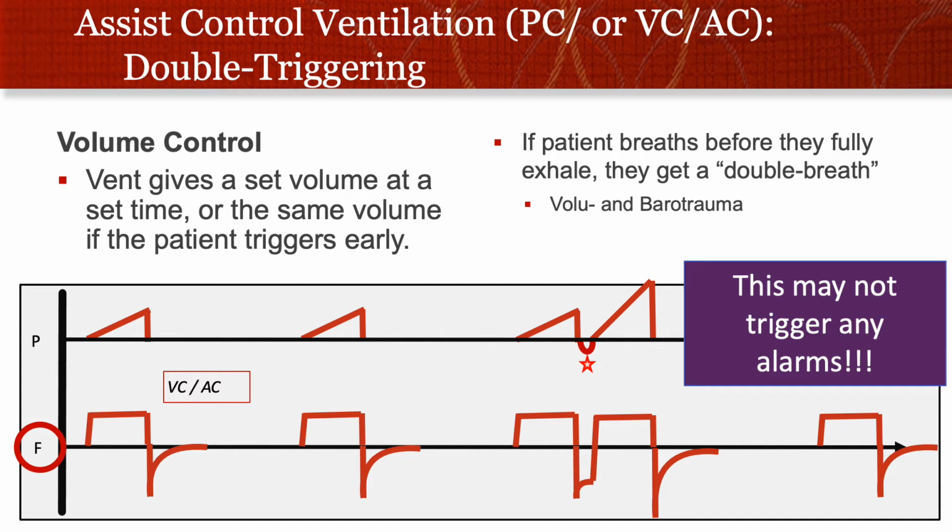We're breathing barely enough. They're acidotic. Well, that's a huge trigger to breathe, and so patients want to breathe. They're septic and have metabolic acidosis. They want to breathe that acid off. And so they want big breaths, and they want them all the time. And so they may say, my 300, 400 mil tidal volume is not enough. I want more. And they'll suck in air before they have fully breathed out.